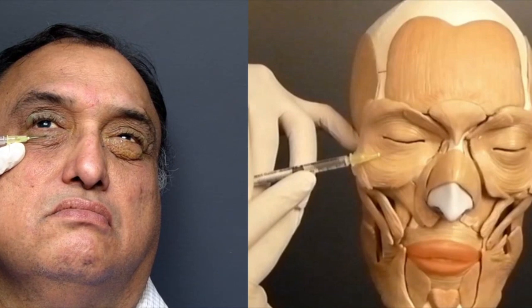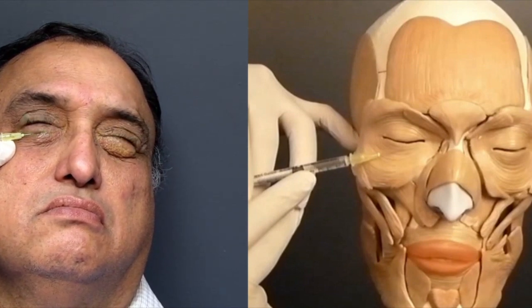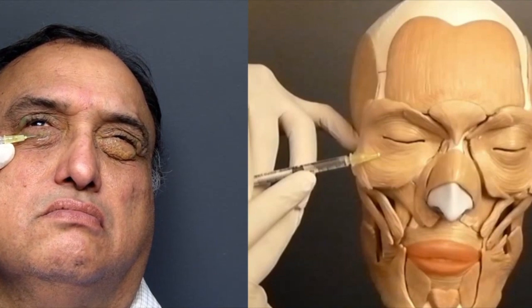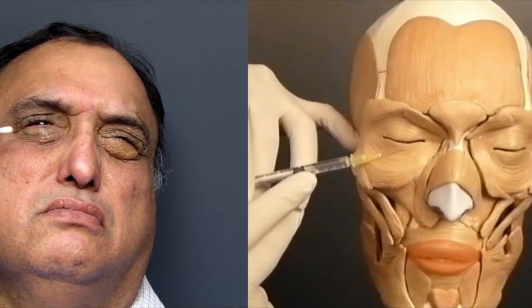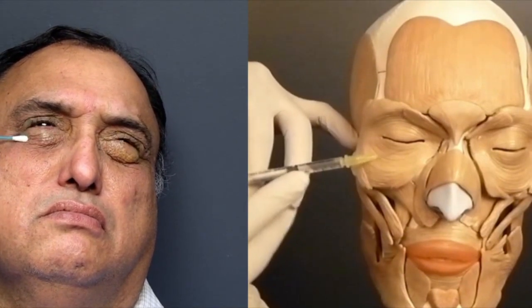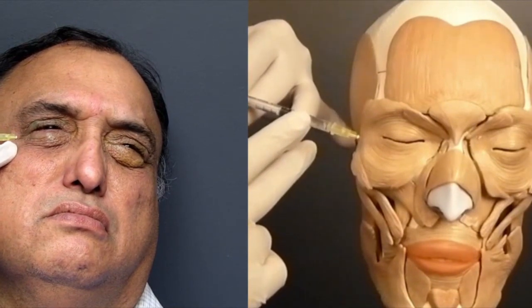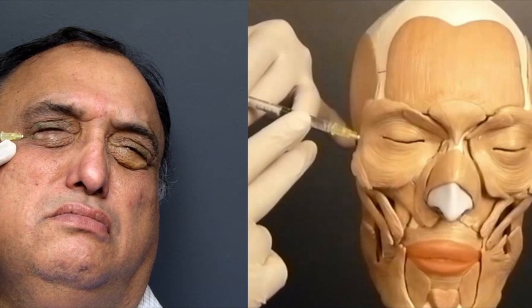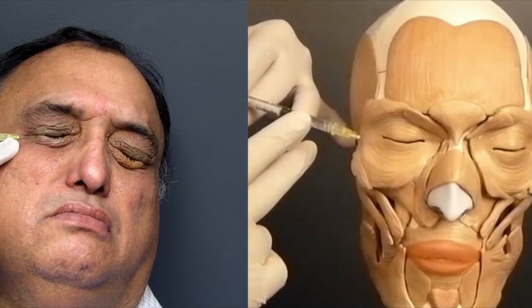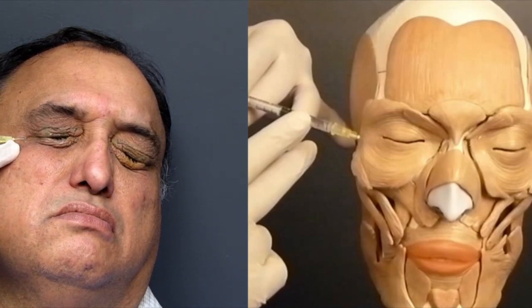We will now inject the pretarsal lower eyelid in the mid-pupillary plane. It is always important to finish the eyelid injections first because the eyelid skin is thin, and then move to the brow. After giving brow injections, it is not a good idea to come back to the eyelid because the needle sharpness is lost by then.